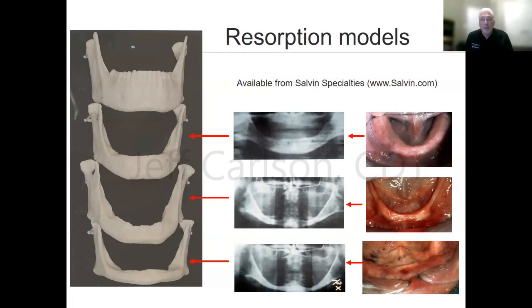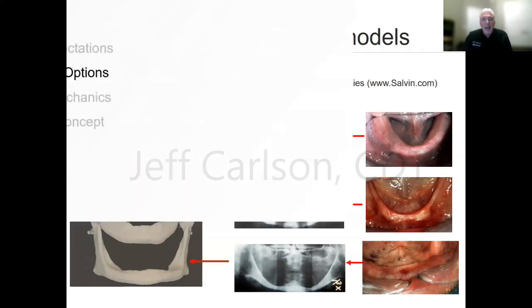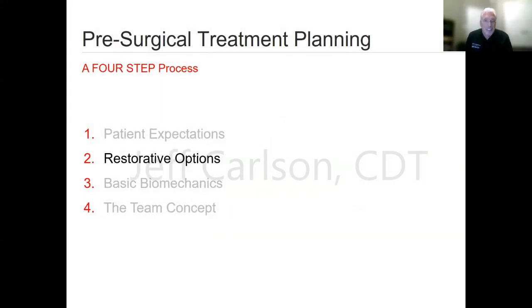I've been involved in removable prosthetics since the mid 80s, quite honestly, and with implants in the early 90s with removable. Patients can really understand looking at a radiograph, and then intraorally, that's how this translates. For less than, I don't want to say the price, it's very inexpensive. Patients like to touch things, look at things, and it gives them another level of understanding. So I would really recommend that you get those.